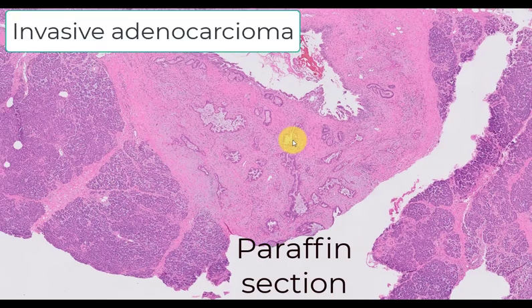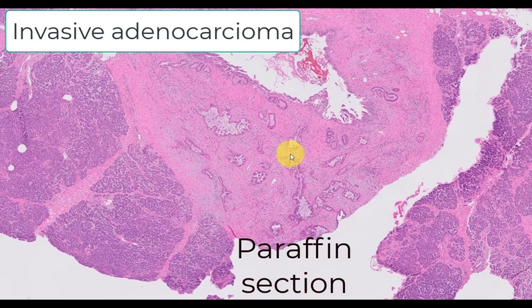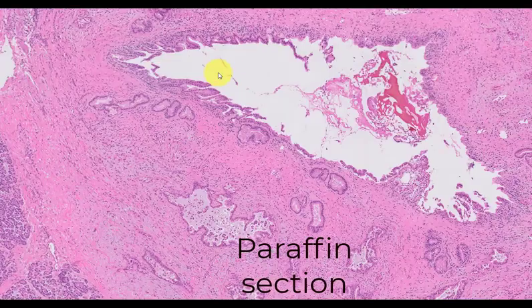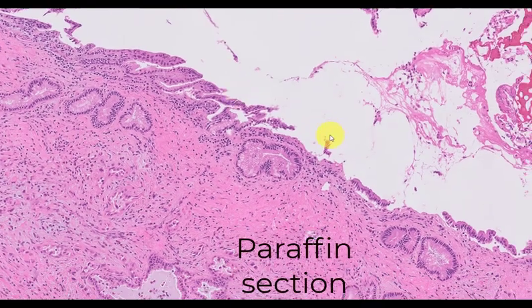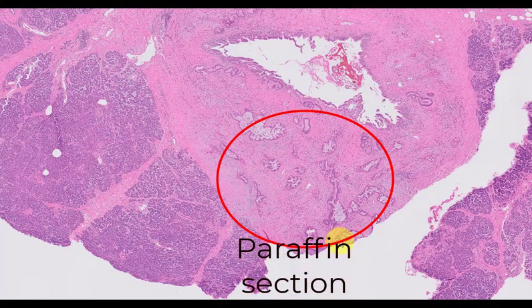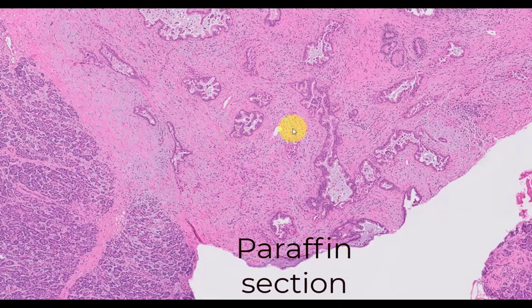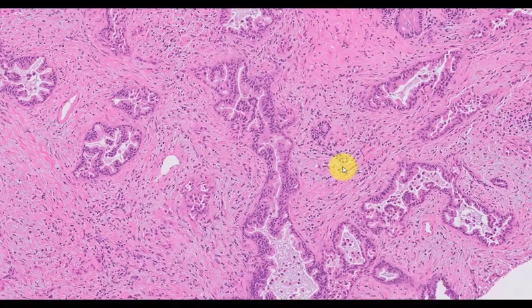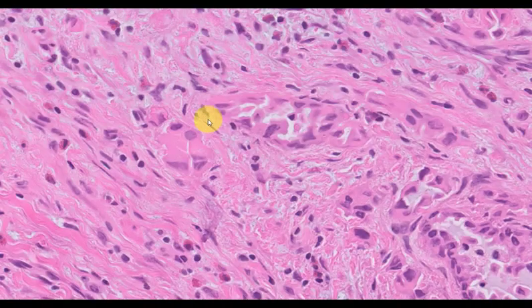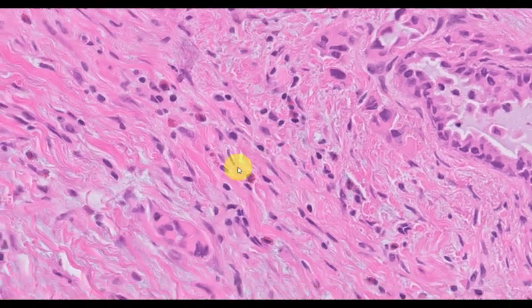So this turned out to be invasive adenocarcinoma at the transected margin. Here's the permanent section. Here's that duct, the pancreatic duct, either the main duct or one of its branches. That looks fine. But I think, as you might have guessed, this area looks awfully suspicious, right? The randomness, the angulation that you see in this gland, the random distribution, and the desmoplastic stromal response make this an invasive adenocarcinoma. In addition, there are these small glandular profiles that are icing on the cake.